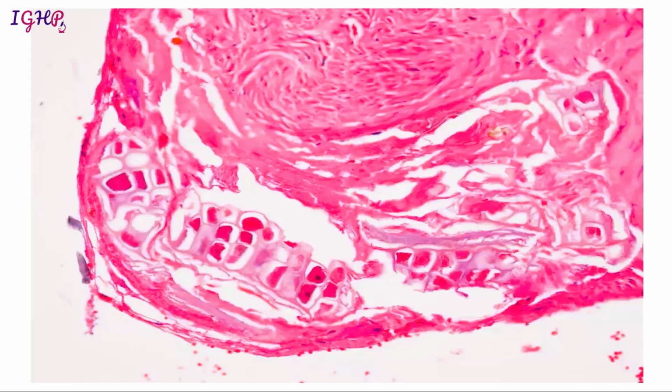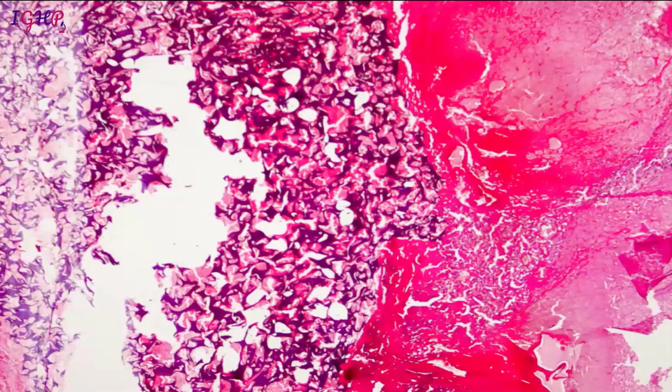Sometimes you do see vegetable material when you are looking at the gastroluminal biopsies, and at times this luminal vegetable material looks like parasites. So the important point is to identify them as not parasites. And how do you identify them? You look at the reaction in the surrounding mucosa, and if there are no eosinophils, that tells you that most likely these are plant cells, and the cell wall is also going to be thick. So that is another way to identify them.